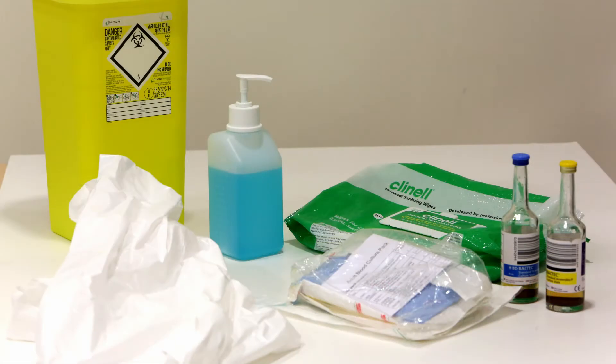The equipment you will need in order to take a set of blood cultures includes an adult blood culture pack, an apron, and a sharps box.